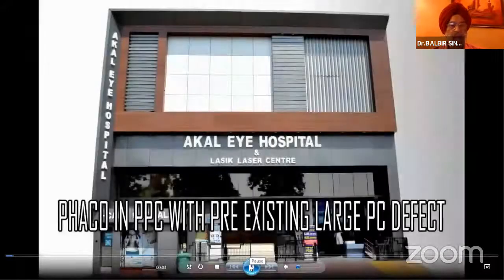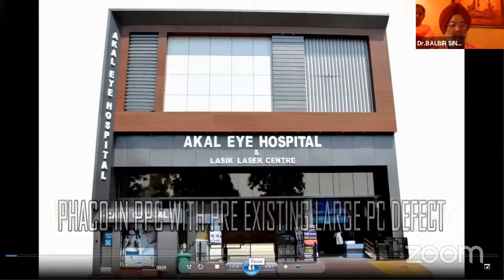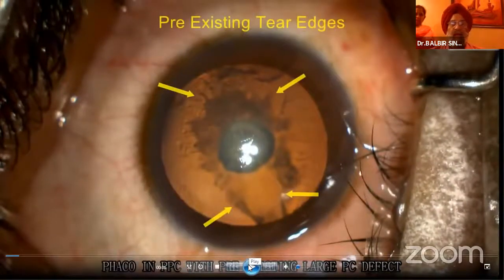To start with, please see the pre-operative tear, which I have marked. Here you can see those arrows marking the pre-operative tear, which was diagnosed pre-operatively on the slit lamp, and even under retroillumination I could see it very clearly.